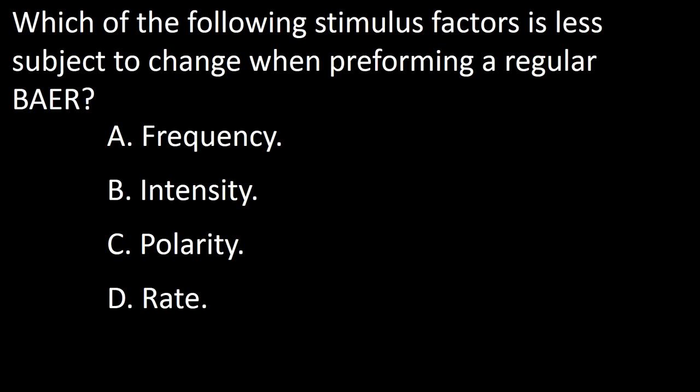Next question. Which of the following stimulus factors is less subject to change when performing a regular brain auditory evoked response? A. Frequency, B. Intensity, C. Polarity, D. Rate.